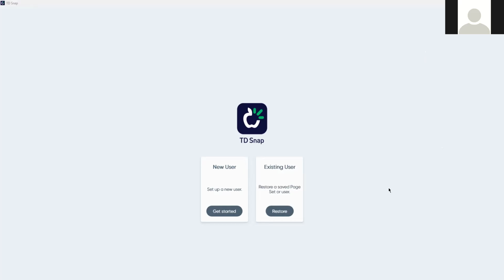This channel was created for users, SLPs, therapists, teachers, and families in the Arkansas area. I am the solutions consultant for the full state of Arkansas at Tobii Dynavox. And today we are just going to start within TD Snap kind of from the very beginning.